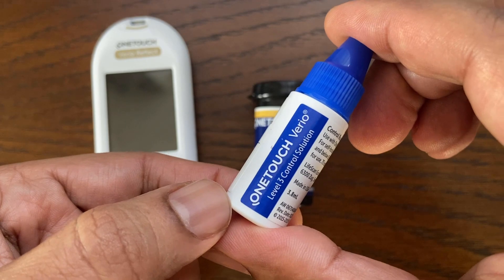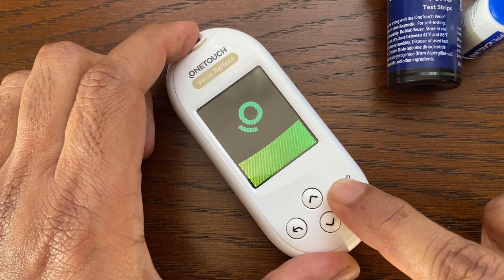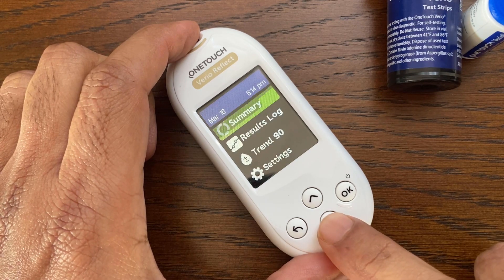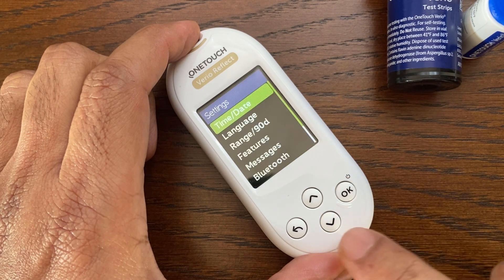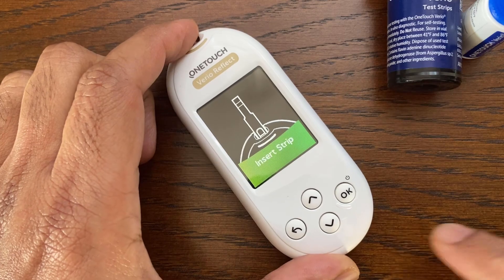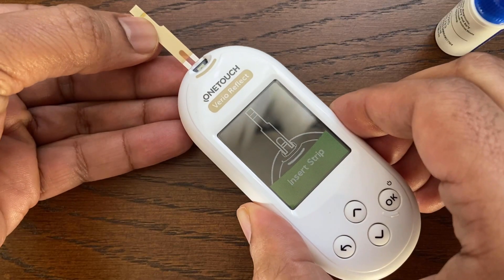The first step is to prepare the meter for the control solution test. Press and hold the OK button to turn the meter on. Using the arrow button, highlight Settings, then press OK. Scroll down to Control Test and then press OK.